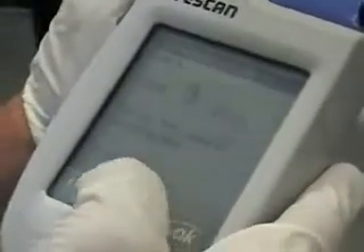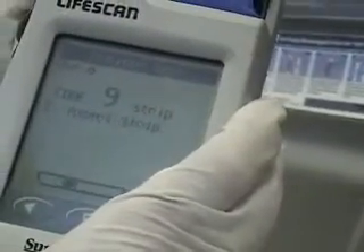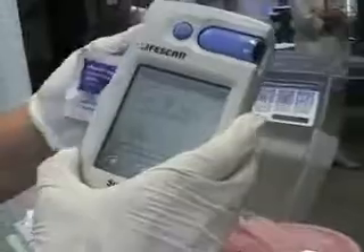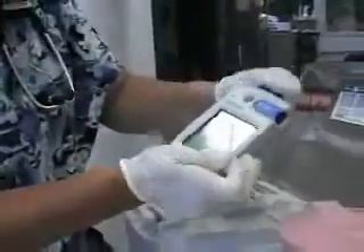Now it's saying please wait. It says apply blood. So I'm going to set this down and insert this strip here. I'm going to put a little drop of blood on, and I'm going to insert it right into here. Then it will give me my blood sugar level.